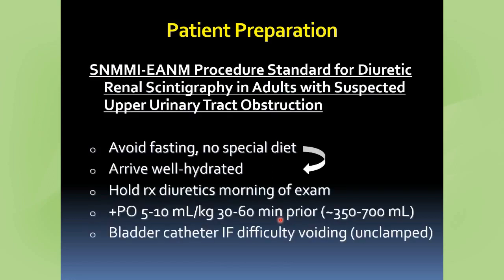So what's going on here? Well, it turns out that it's a little bit confusing, but if you go to the Society of Nuclear Medicine and look at their guidelines under renal, it actually turns out in 2018 they made 3 guidelines on the topic. So you really want to go to this one that's titled here. They have one that I was referencing on the last slide that's kind of a more generic one. It includes things like DMSA and evaluations for renovascular hypertension. So it covers everything, and because of that, it also doesn't go into as much depth.